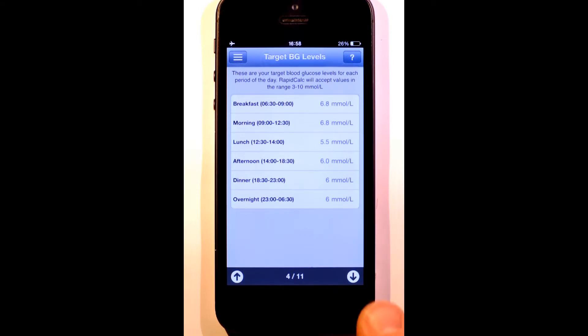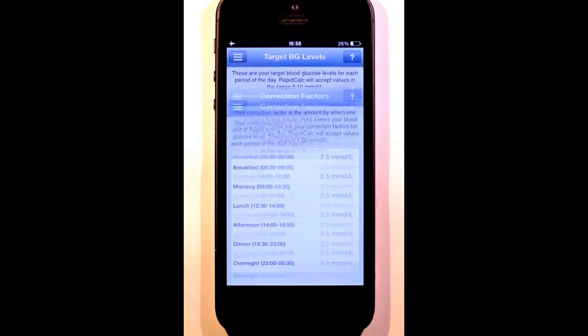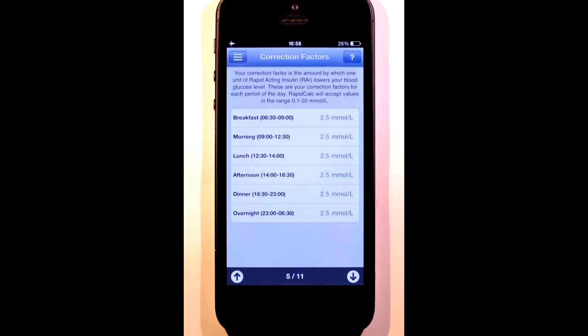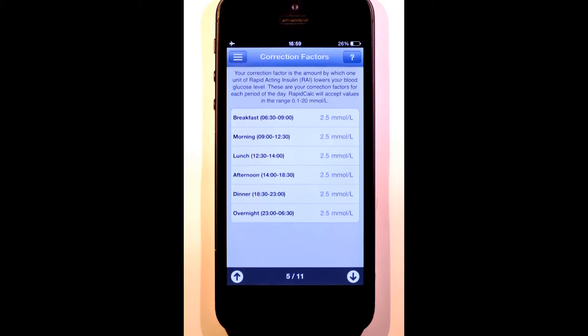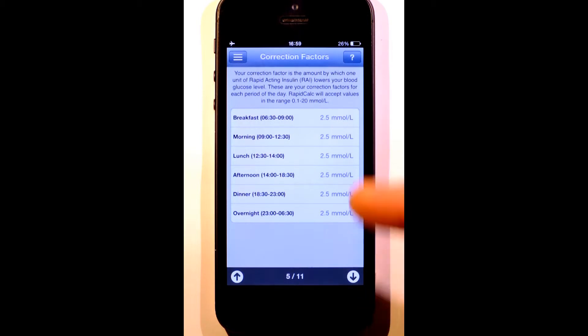Now we'll move on to correction factors. This is the amount by which one unit of insulin will lower your blood glucose. Or to put it another way, it reflects how sensitive you are to insulin. It is quite common for your body to respond differently to insulin at different times of the day. In my case, as you can see, they all happen to be the same.